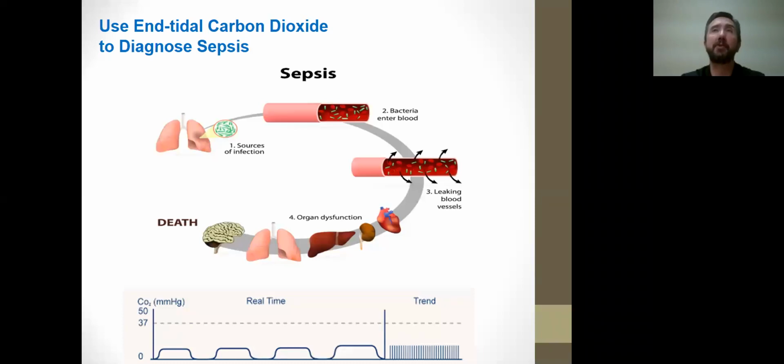The most dramatic demonstration of this process is during cardiac arrest. So that said, therefore, end-tidal CO2 is inversely proportional to lactate. As lactate levels rise in septic patients, end-tidal CO2 levels are going to drop. Very interesting factoid of information concerning sepsis.